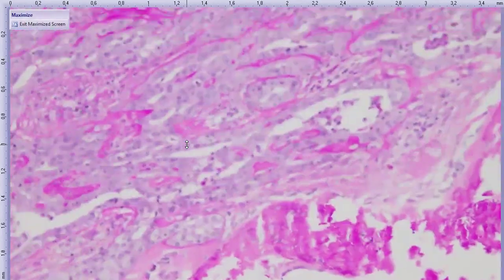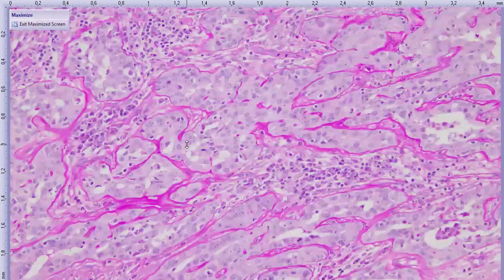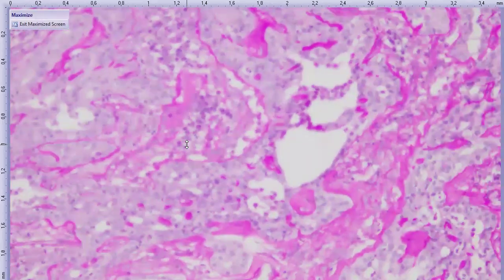We'll get to it later, but just saying any epithelial neoplasm can have basement membranes, right? So if you have a metastatic carcinoma to the eye, it could have basement membrane. So we're talking specifically about these thick and irregular ones, kind of like that.